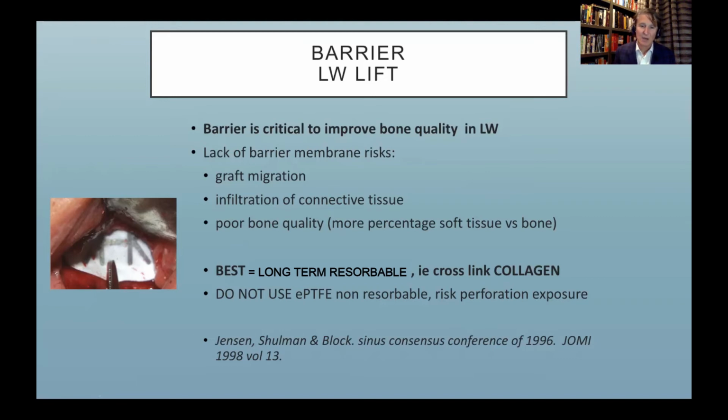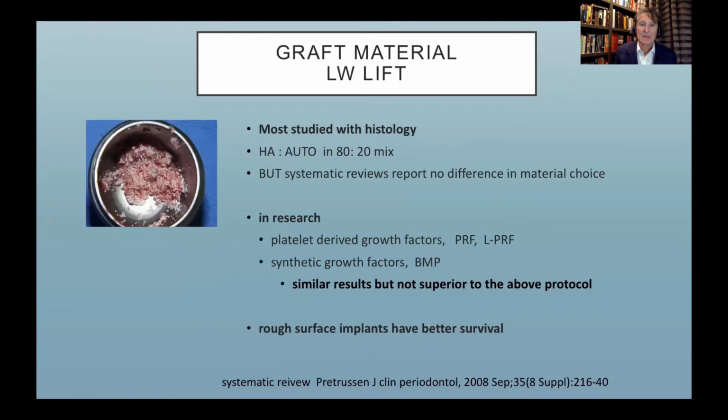That's long enough to block the epithelium from growing in, but it doesn't give you a risk factor of an exposure. So what about the graft material? As we saw already from Wheeler's group, that 80-20 mix of hydroxyapatite and autogenous is best.